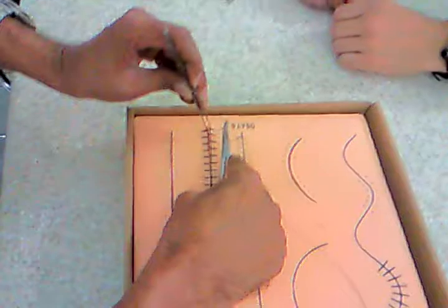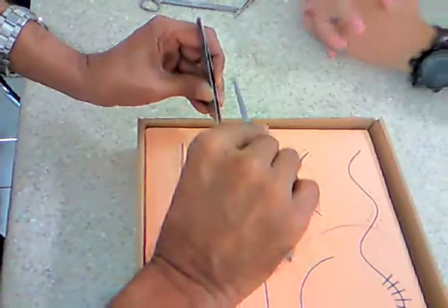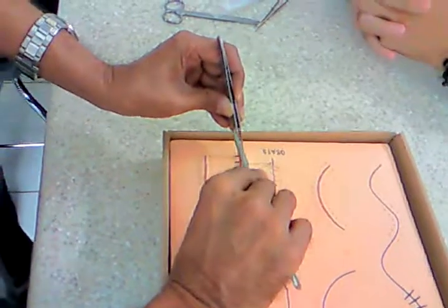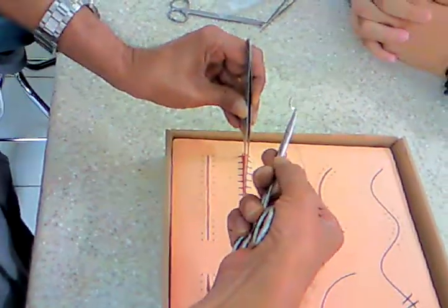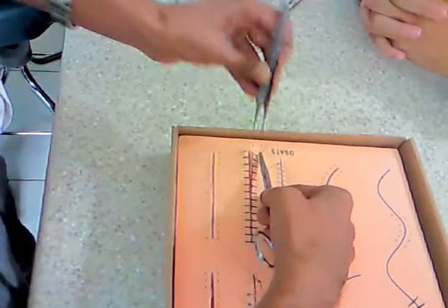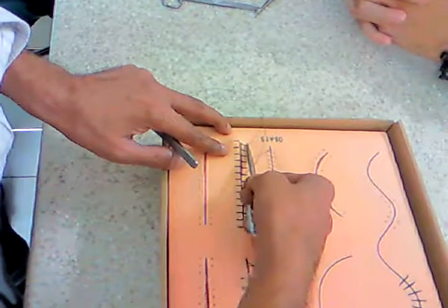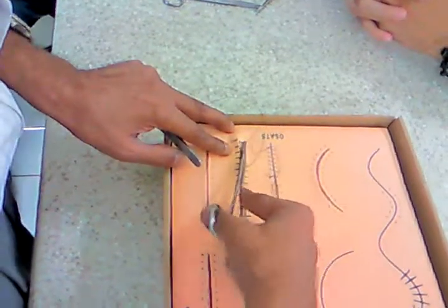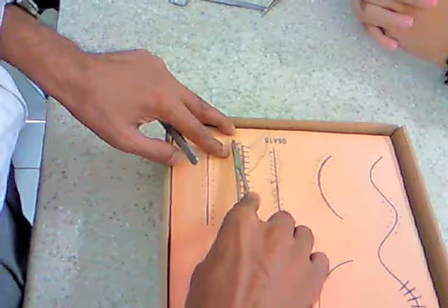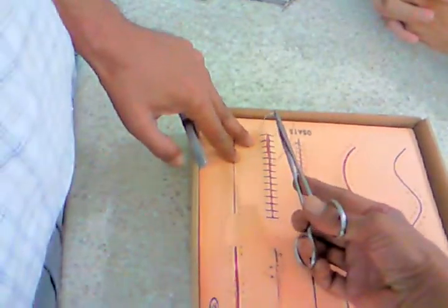Okay, so the first one, as usual, when you're taking a bite, just a few smaller, finer points. See, it's a curved needle, right? So try to follow the curve of the needle with your bites also. So that's what we are trying to do, basically. Take one and pick up the other side. See the tip, push it out. Okay, as usual. Catch hold of it. Don't pull it straight like that, but try to pull it out like that. That's the usual technique for all suturings.